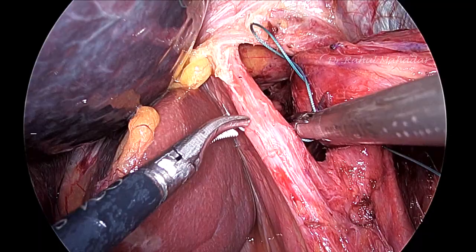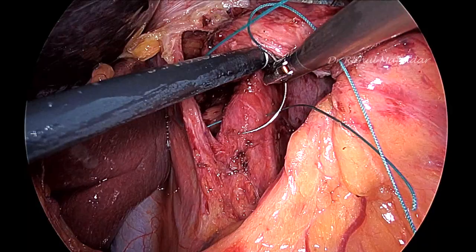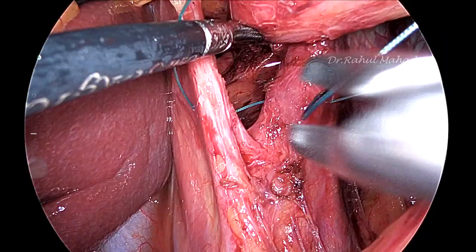And here also the exit point you should see, because caudate lobe of liver is always there, that can lead to a bleeding and the field becomes quite messy. So I always prefer to do a figure of 8 suture for the crura. So entry point and exit point is always you have to see, and then only proceed further.